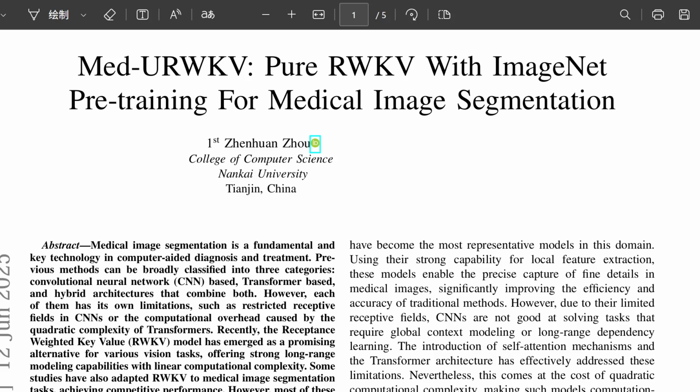Not quite that simple. Especially for medical images, transformers have this major drawback: quadratic computational complexity. Meaning if the image size doubles, the processing power and memory needed can go up by 4 times, maybe even more. Ouch. That sounds like it would explode with big 3D scans or high-res pathology slides. It does. That scaling issue is a huge barrier for actual clinical deployment. Hospitals might not have the super high-end GPUs needed to run these efficiently.